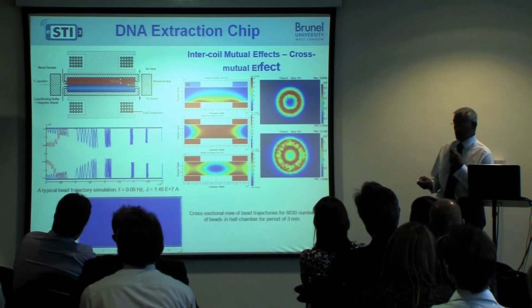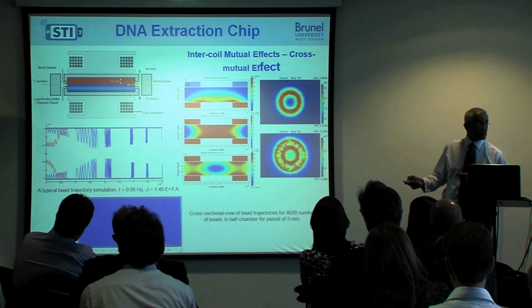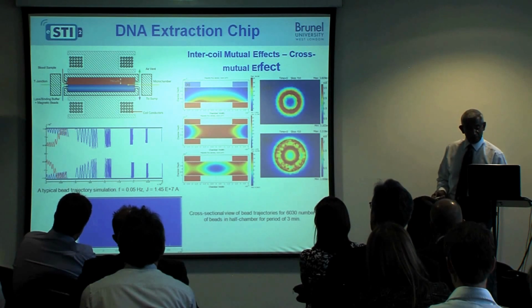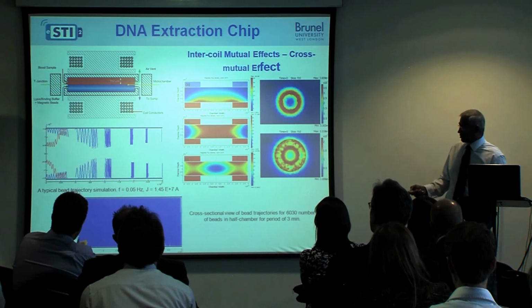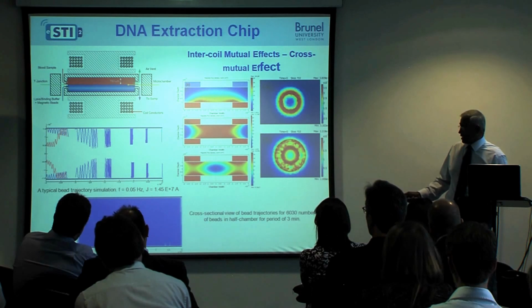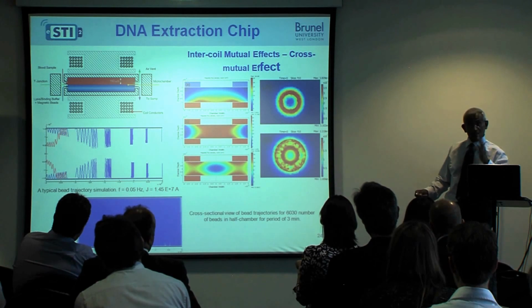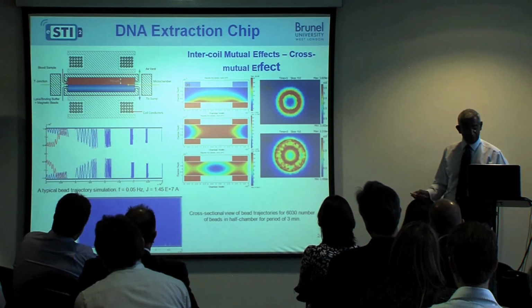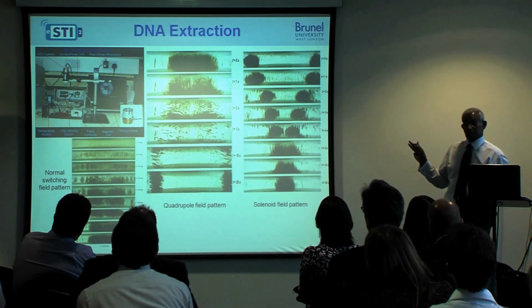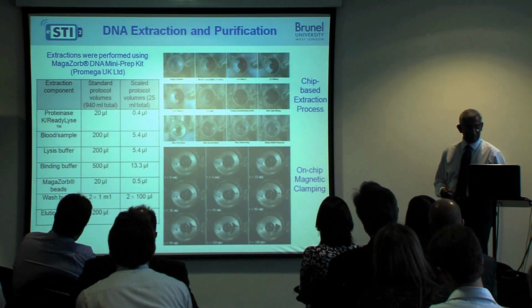In order to understand what goes on, we did some modeling work to find out how the magnetic field changes. As a result, all the understanding is known to us, and so we can manipulate it. This simply shows that if you release these beads at this end, they will cover the entire chamber that we are interested in, and therefore you can move them up and down and sideways and so on. So this gives you a quick picture of how we can manipulate these beads, bring them together, and take them out by applying the switching magnetic field.